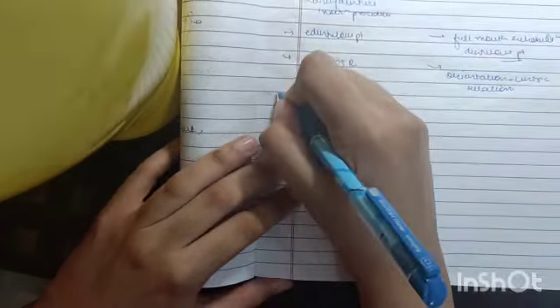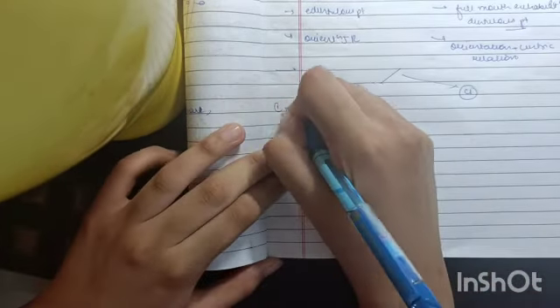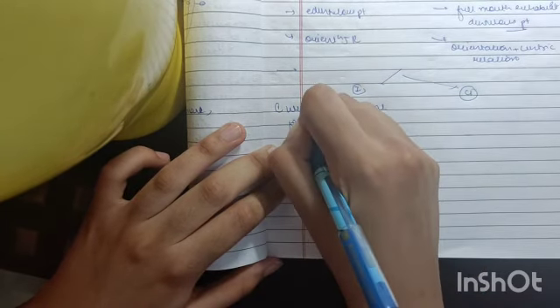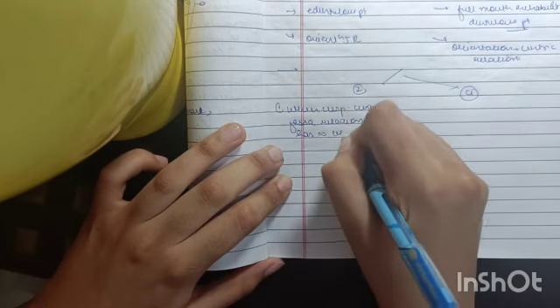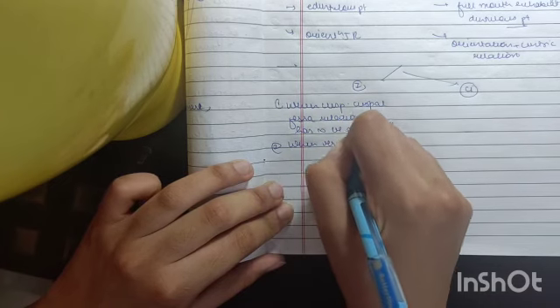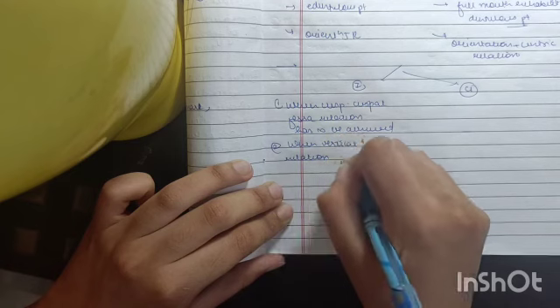Alright, now after the types, we will talk about the indications and contraindications of using a face bow. In indications: first, when the cusp and cuspal fossa relation has to be achieved. Second, when vertical jaw relation has to be changed.